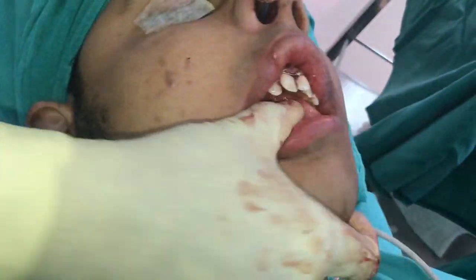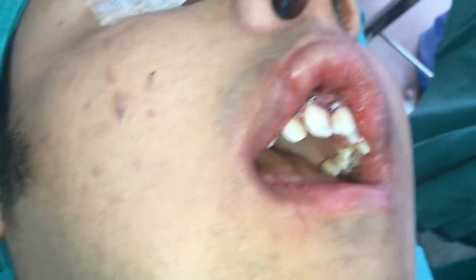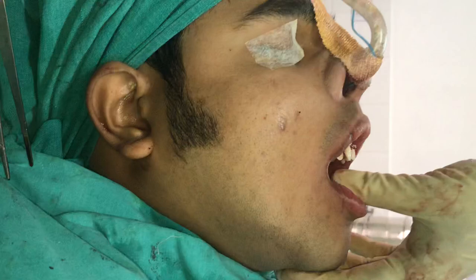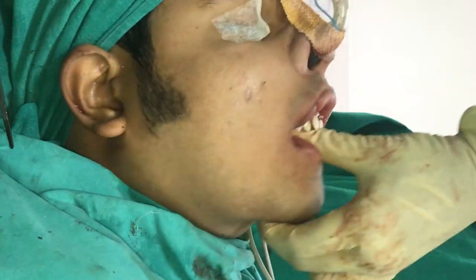Take it like this, come down and take it on the sides. Now you can see how the mandible can be moved in multiple directions.